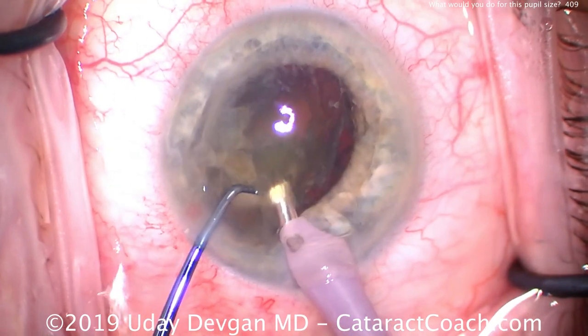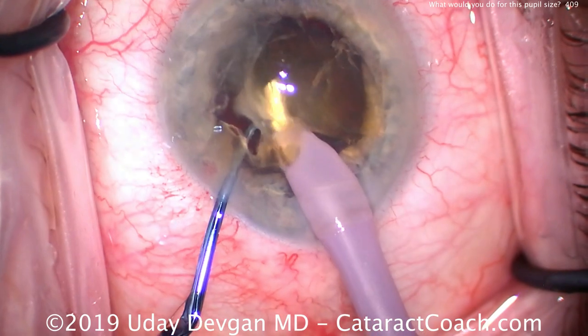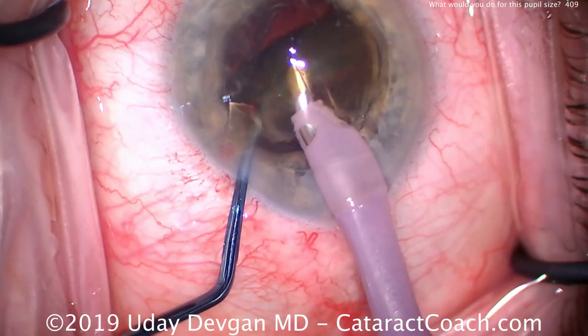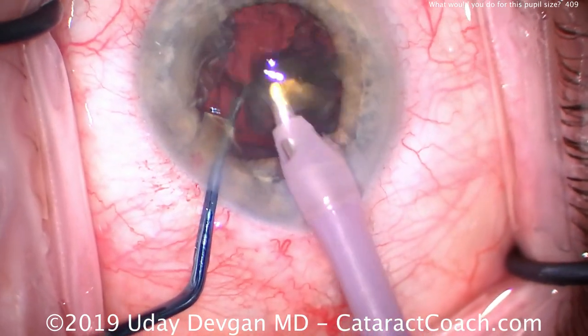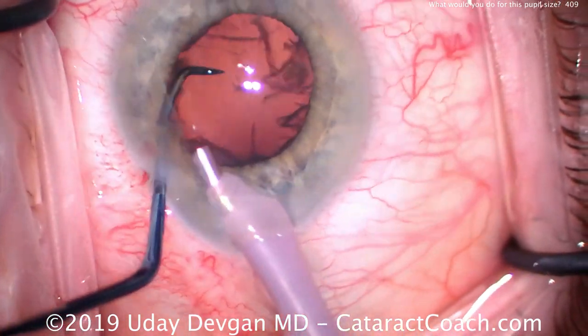Notice that we try to operate at about the iris plane — we don't want to ride the corneal endothelium, don't stay too close to the cornea, we don't want to damage the endothelial cells. We have plenty of viscoelastic to protect that cornea. This patient ends up with a perfectly clear cornea on post-op day one.